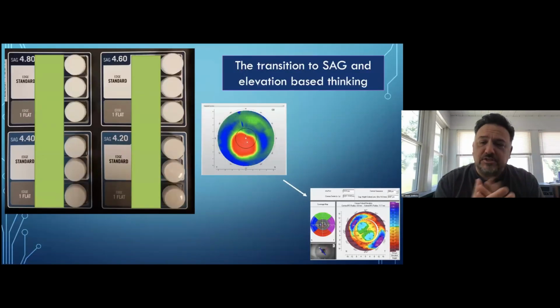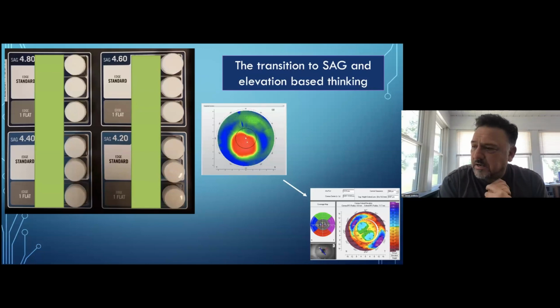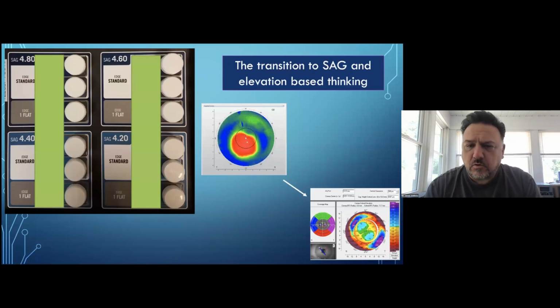I remember years ago, I'm at the Indiana University School of Optometry, and I remember many years ago talking to a lab manager about the idea of referring to scleral lenses more off of sag values than base curve, because I thought it just made more sense to work off of elevations and clearances rather than curves, when ultimately our goal is to generate a certain depth to a lens. And at the time, that lab manager said, I don't think you're going to get practitioners to be able to change their mentality of thinking from curves and widths and radii to sag and elevation.